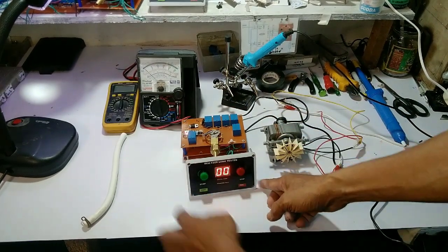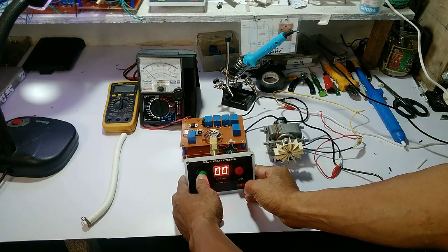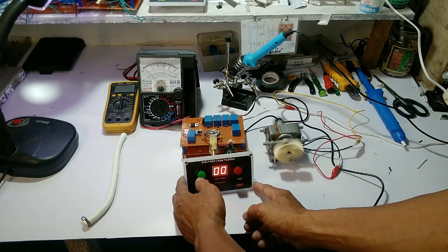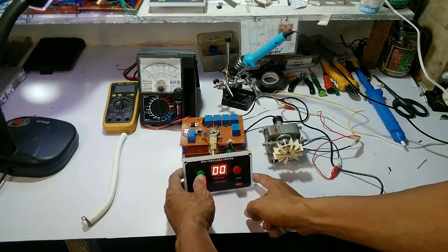Ang operation po nito ay ganito: once na pinindot nyo po ang start button, ay aandar po ang air pump at pupunoyin nyo ng hangin ang dialyzer.